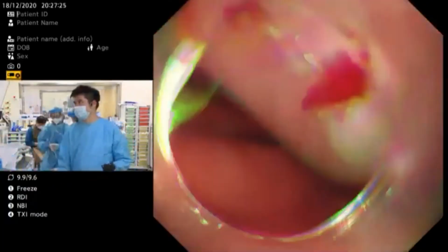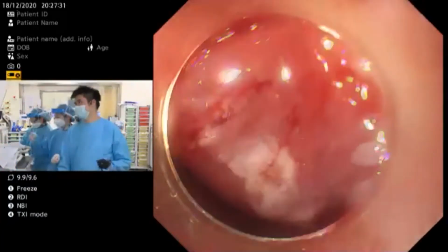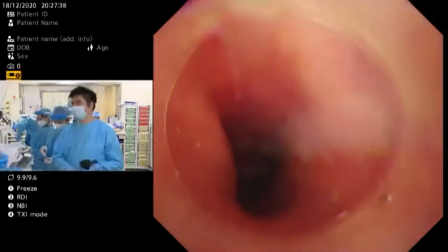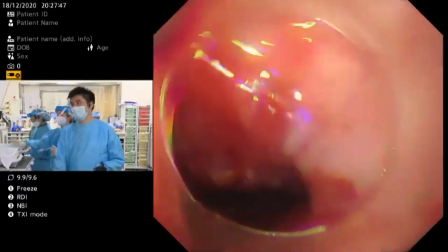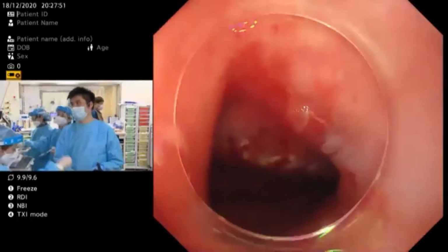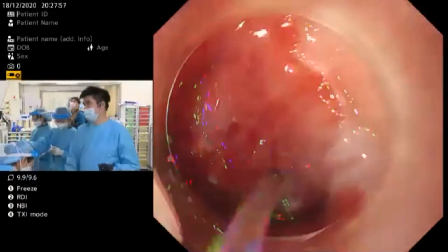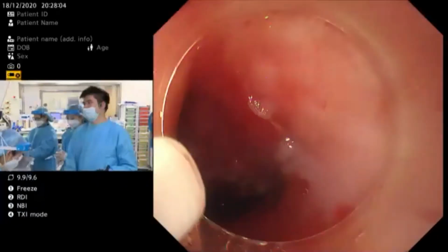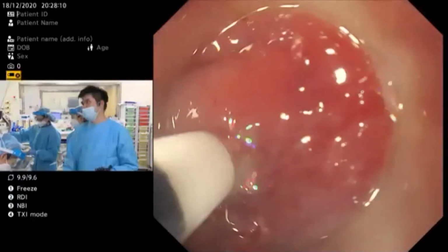Does the non-elevation of a region or a part of a lesion is an indication to give up, or you would continue? I would review the indication. So I don't think the non-elevation is an absolute contraindication. So we always go back and see the original lesion description. As you may be aware of the Japanese guidelines, they have preset specific criteria for a potential indication for ESD. So sometimes even an ulcerated lesion can have significant fibrosis, but if it's still fulfilling the original indication criteria, it may not be necessary to abort the procedure at that juncture.